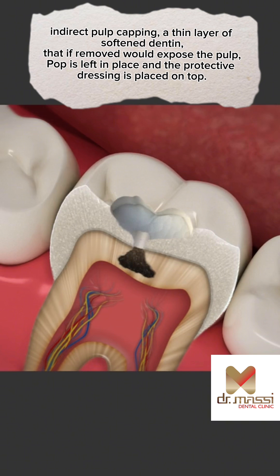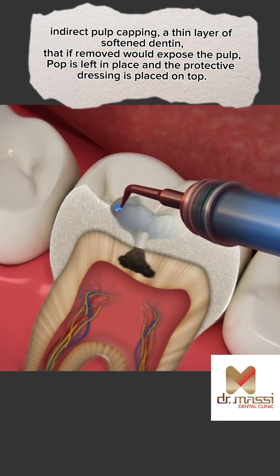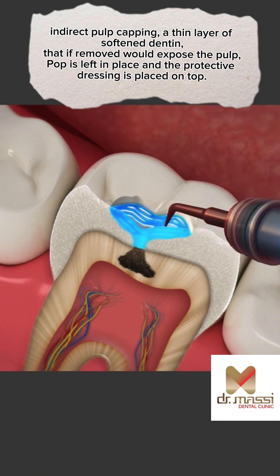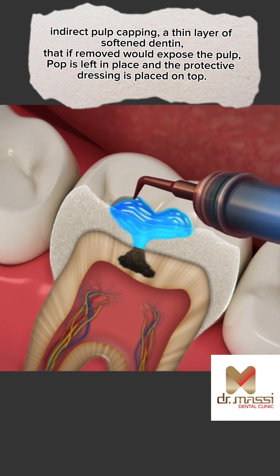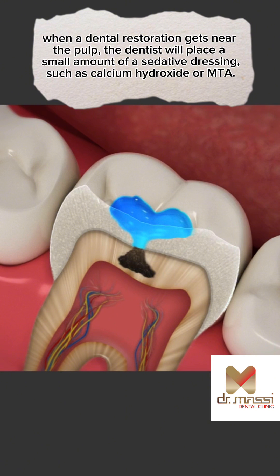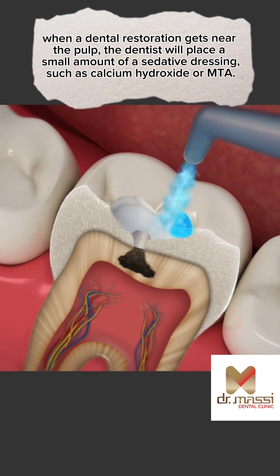In indirect pulp capping, a thin layer of softened dentin that if removed would expose the pulp is left in place, and a protective dressing is placed on top. When a dental restoration gets near the pulp, the dentist will place a small amount of a sedative dressing, such as calcium hydroxide or MTA.